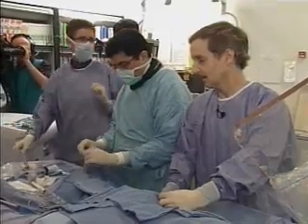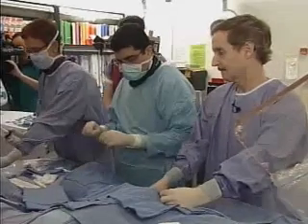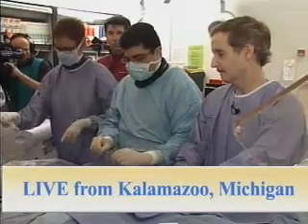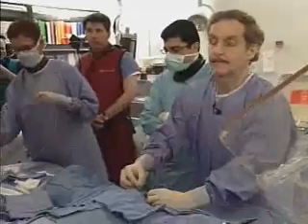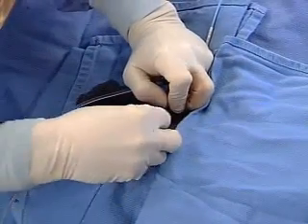Yeah, I think in the United States trial, where we didn't have all the stent lengths available, and we didn't know if we were putting in a drug stent or a bare one, there was a fair amount of ballooning around the stents, and we saw about 5% of the patients had blockage outside the stent. And so now, having learned from that, the European trial, using a very similar protocol, had about a 1 or 2% blockage outside the stent, which is extremely low and much better than a bare stent, actually.